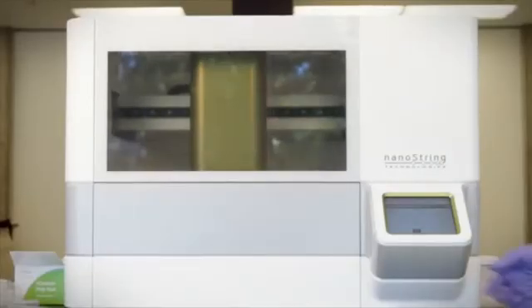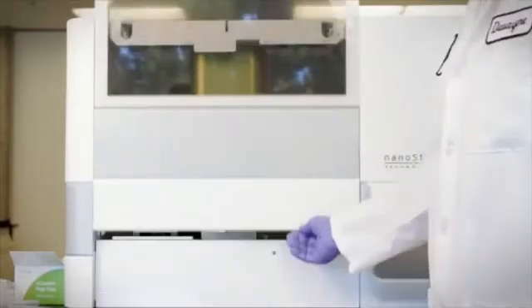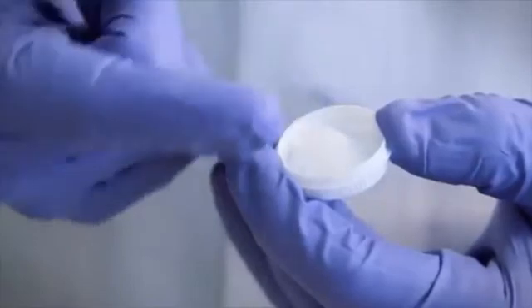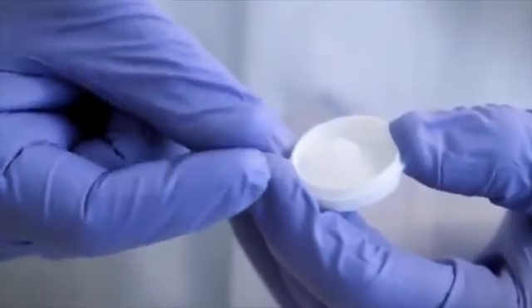The pipette head of the prep station will move to the front of the machine and the door will be unlocked. Using a gloved finger, take a small amount of the silicone grease supplied in a white plastic container and briefly touch each one of the O-rings. Then, using a different finger, smear it around the O-ring to make sure it is evenly distributed across the entire O-ring surface. Then, using a clean glove, wipe away the excess grease from the O-rings.